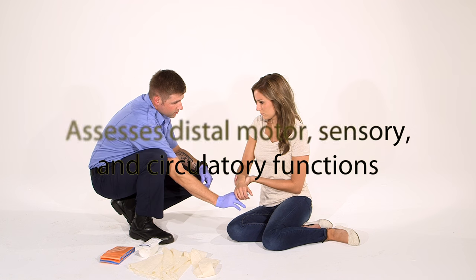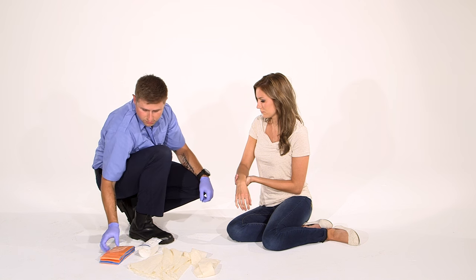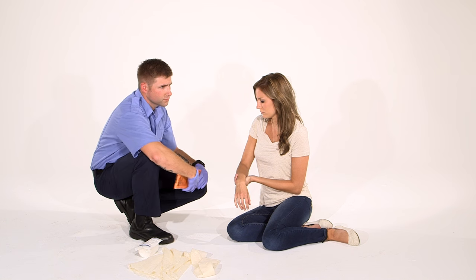Can you squeeze my fingers? All right, without looking, can you tell which finger I'm squeezing? Okay. Motor, sensory, and circulatory function are present and normal.